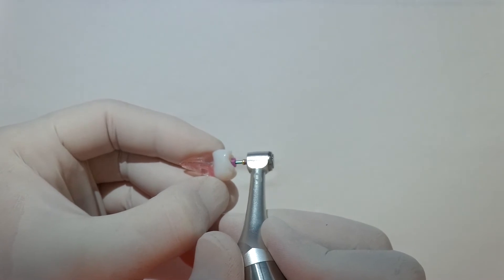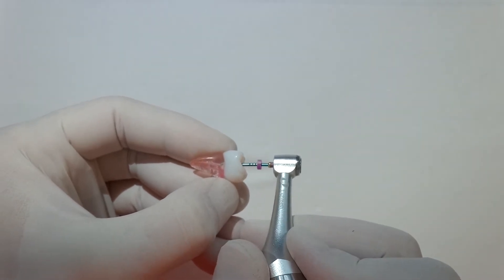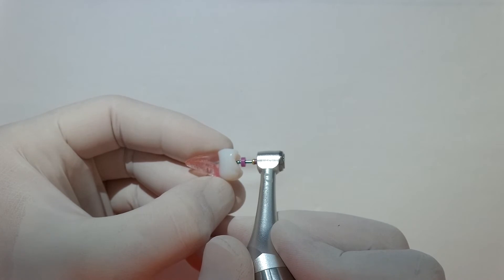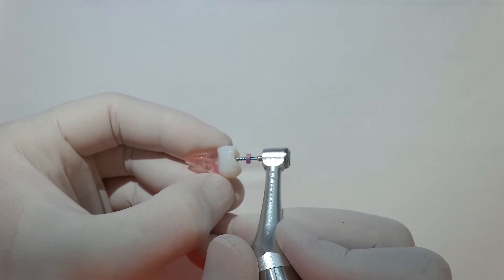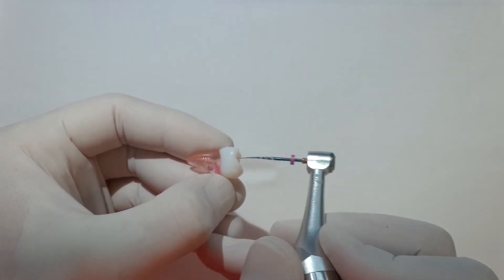That just helps produce the coronal flare, and you can lean it out towards the outside of the root canal just to give yourself a bit more flare if that's what you want. There's a bit of curve on that canal, so we'll just straighten that up a little bit.